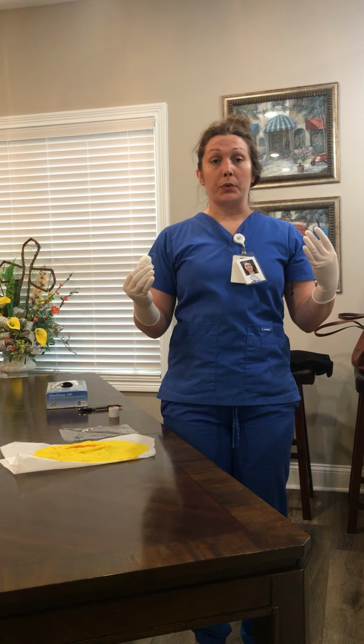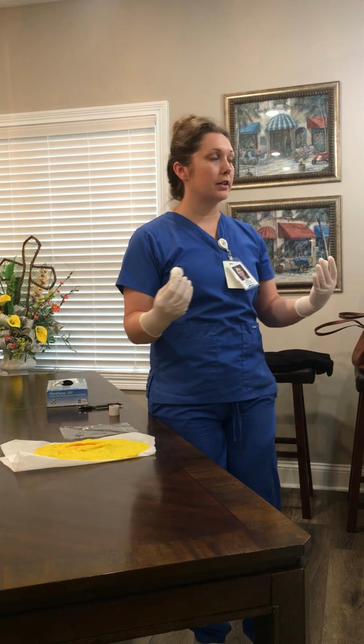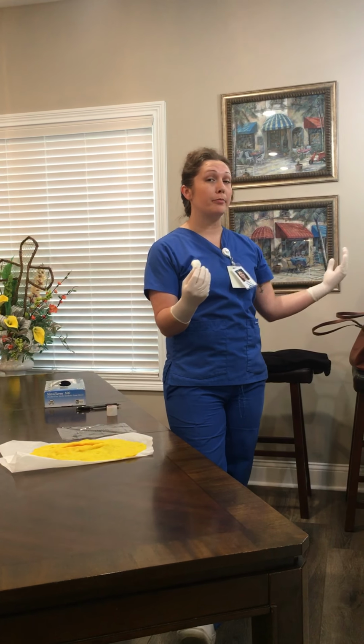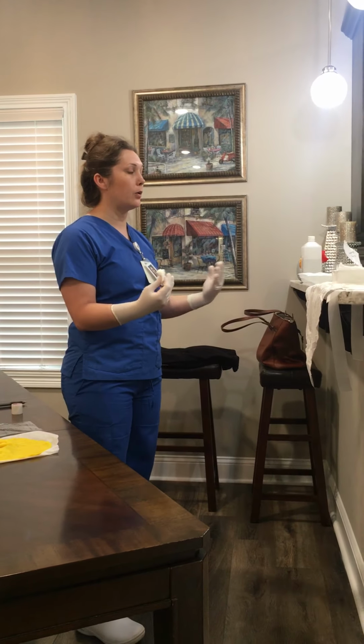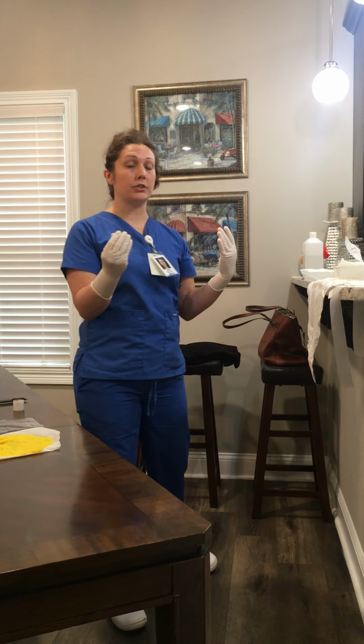Again, you don't want to lower your hands below your waist, so don't throw it in the normal trash can. What works is just using your sterile glove packaging because you know that it's at waist level, it's in your sterile field. So I'm just gonna toss that in there just as so. So for this purpose, we're gonna cleanse it 3 times.